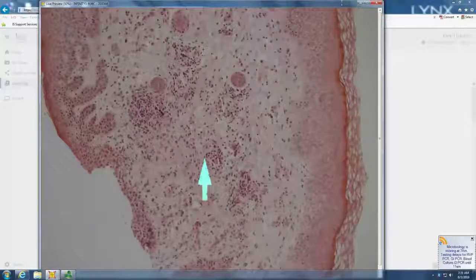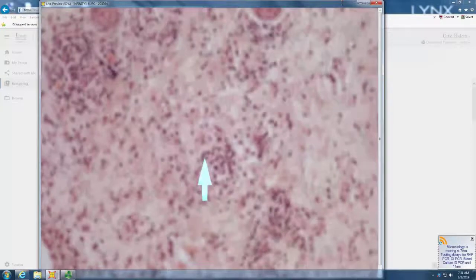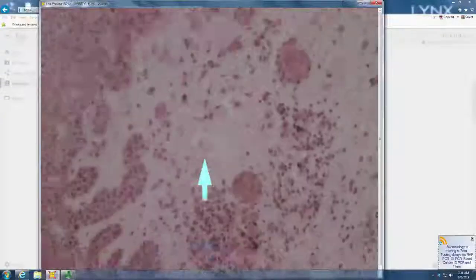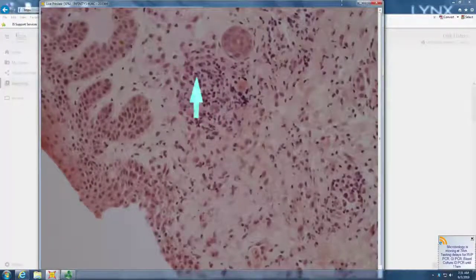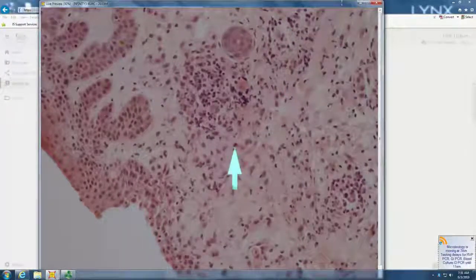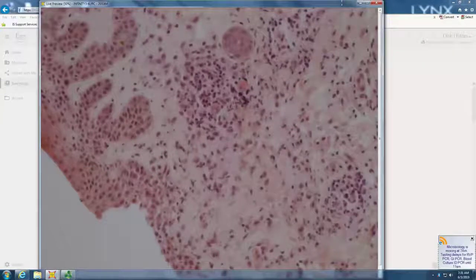There's some sort of dermal infiltrate. Yeah, and is it diffuse, interstitial, or perivascular? Looks perivascular. So kind of perivascular. Is it histiocytic? Can't tell. Is it lymphocytic? It's a little bit mixed. There are lymphs, there's a few polys in the vessel. And there are eos, these binucleate red cells. Some eos. Yeah. So it's a polymorphous infiltrate with some eos, some neutrophils within the vessel.